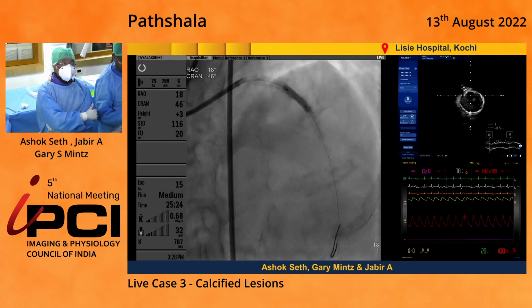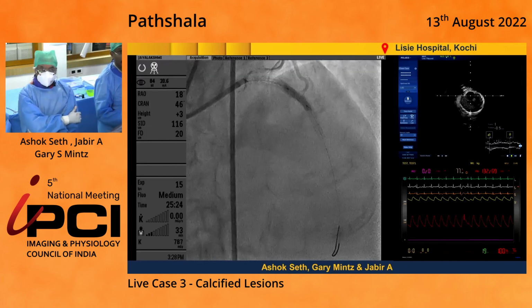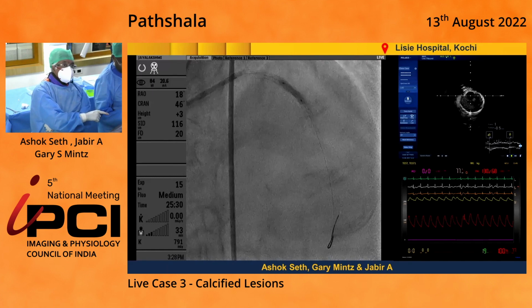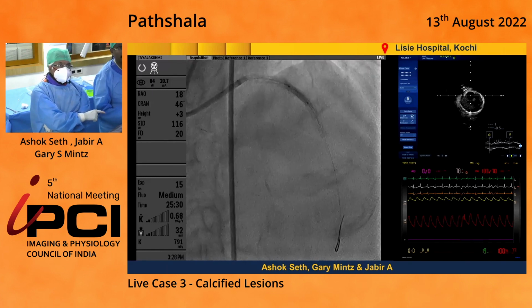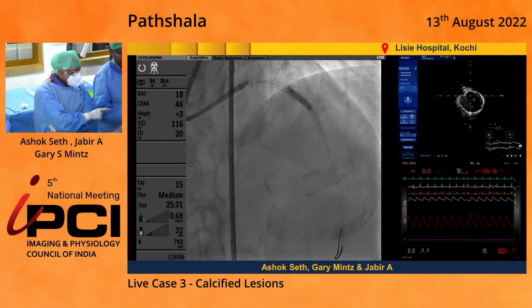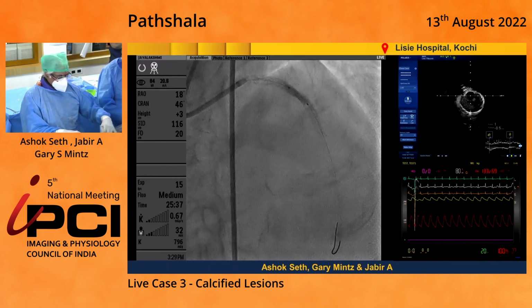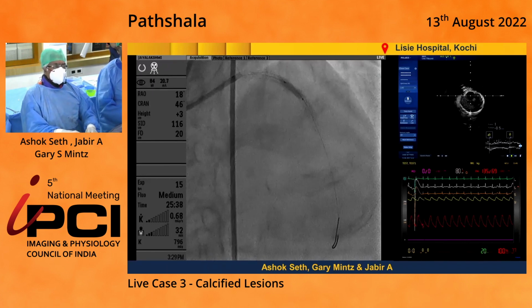So while we're up there, Ashok, Zi just asked a question. What were the original stent types, and what were the diameters of those stents? Did it come down? Yeah, it came down. That means that it could have ruptured as well. So that's okay. Yeah, so it was Onyx 2.75, and I think it's a 3.